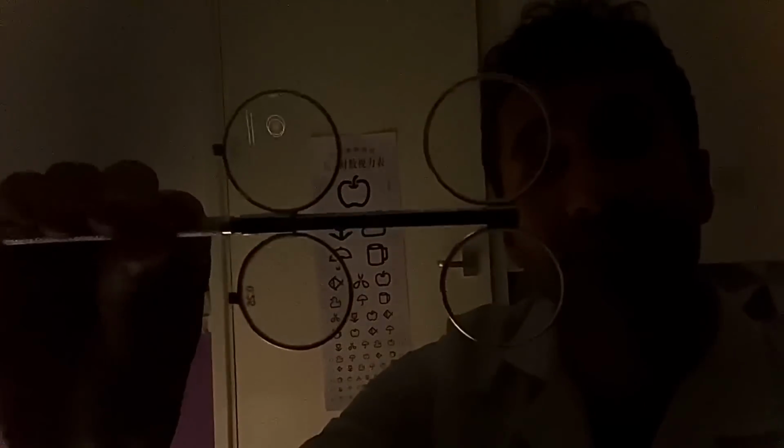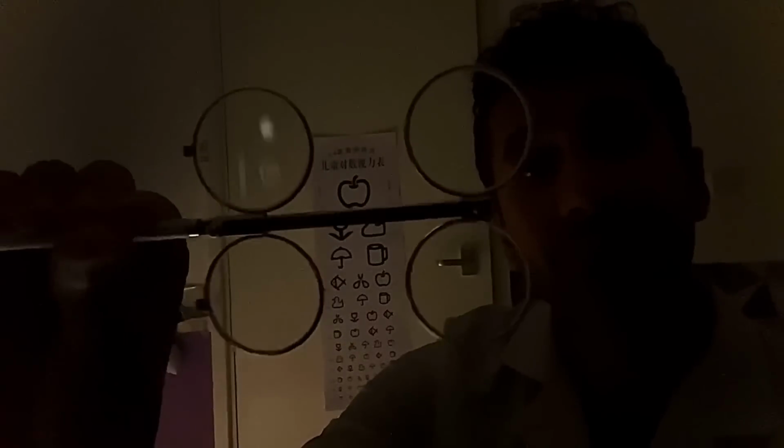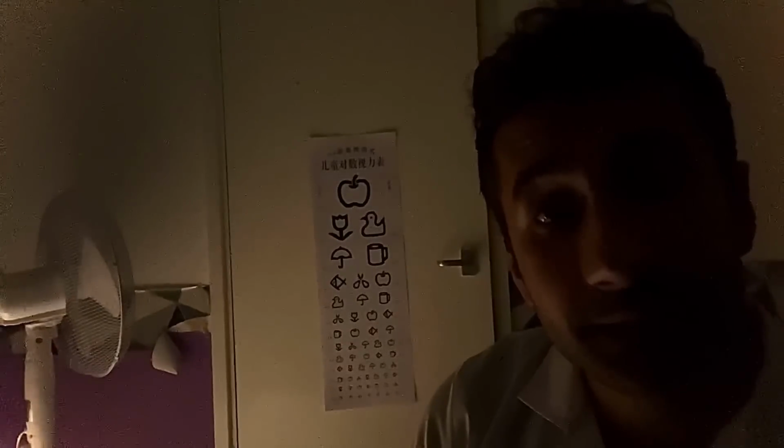Welcome back to the world of clarity. Now you should be seeing quite a bit further down the chart now, with the minus 14 lens in place. I'm going to use some flipper lenses here. I'm going to be using just one of the plus 0.25 and minus 0.25, just to refine things a little bit further. So what's the smallest row you can see down to now? Say the pictures, please.